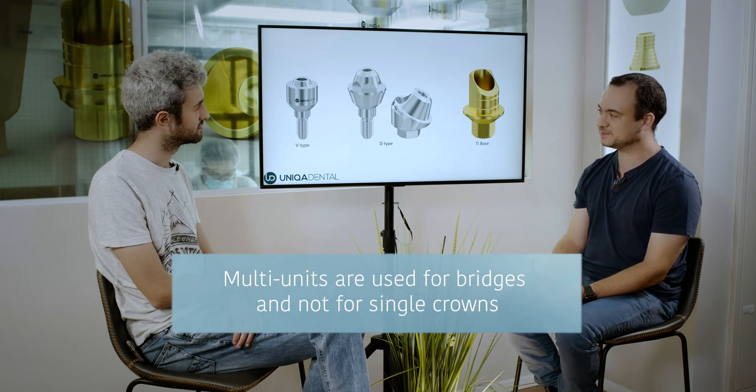From feedback that we receive, I see a lot of confusion considering what part to use in which cases. Can you elaborate a little? Of course. We have different parts for screw-retained restorations for different types of cases. You have the T-bases and you have the multi-units. Multi-units are used for cases when we have bridges, not for single crowns. We would never use a multi-unit for a single crown because we don't have anti-rotational elements between the multi-unit and the implant for straight ones.